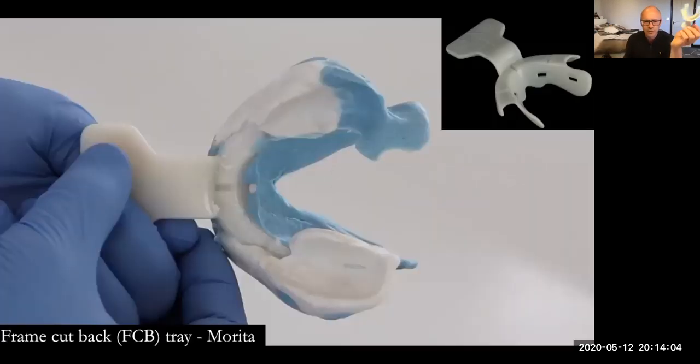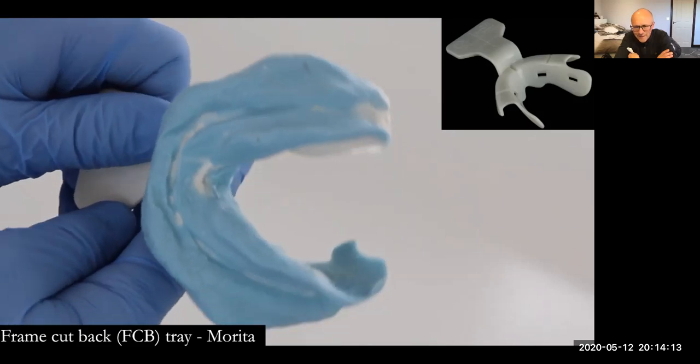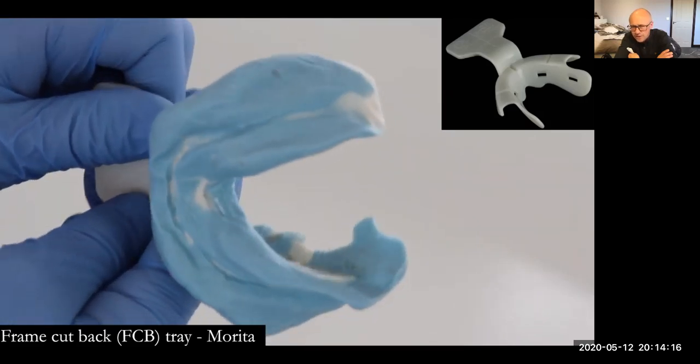That's great. So another question as well, if we just move back to primary impressions again, Angel asked a really important question, which is totally normal to ask. With an FCB tray, this frame cutback tray, this lovely one that Dr. Arbe has designed for primary impressions, is the alginate, when we take the impression, unsupported in those frame cutback areas? It isn't actually. It really does hold beautifully because the base material is so solid, so it doesn't push out there.